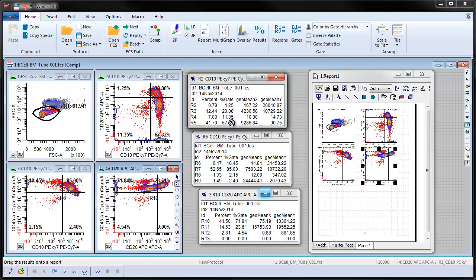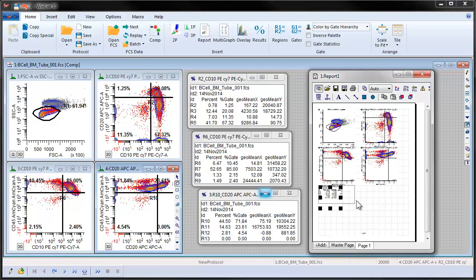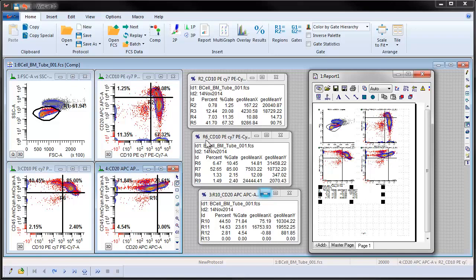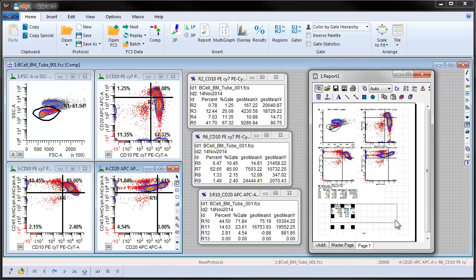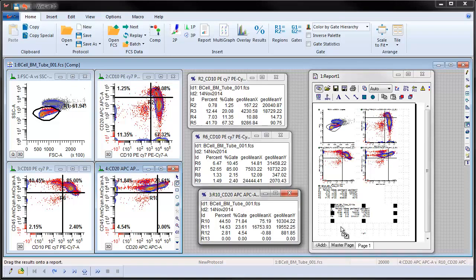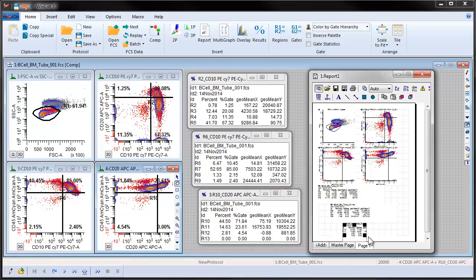You can also add results windows as needed and they can be resized to display all of the results. Once added, simply clicking on and dragging a report element will move it to a desired position on the report layout.